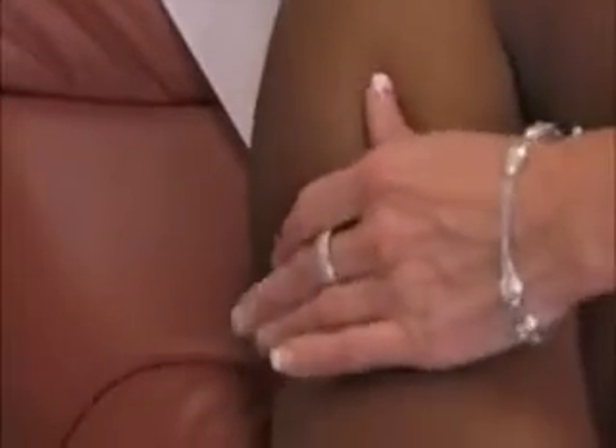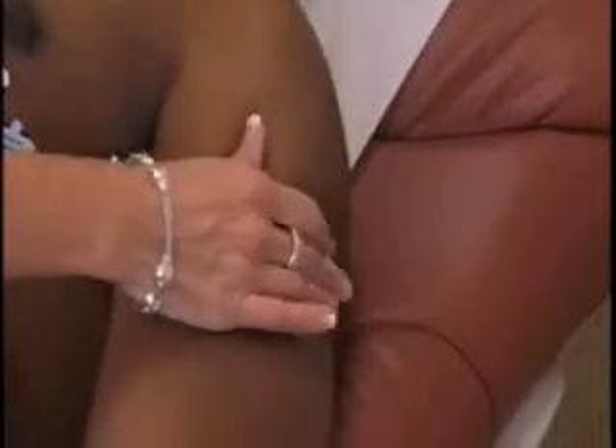Right arm: place the electrode on the right lateral side of the upper arm below the shoulder. Left arm: place the electrode on the left lateral side of the upper arm below the shoulder.